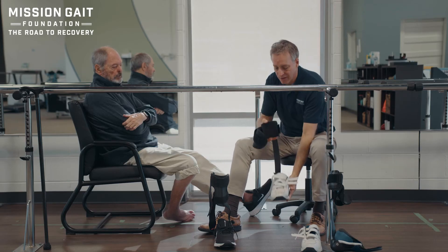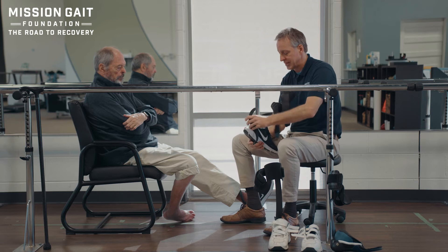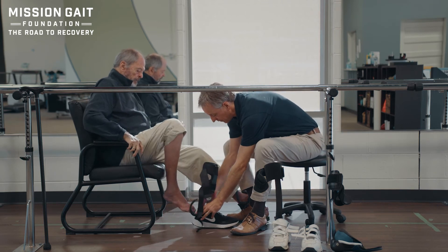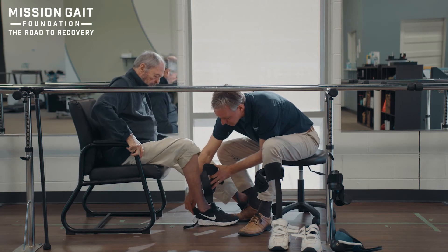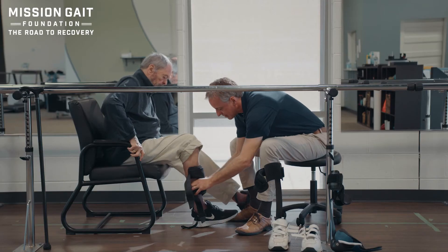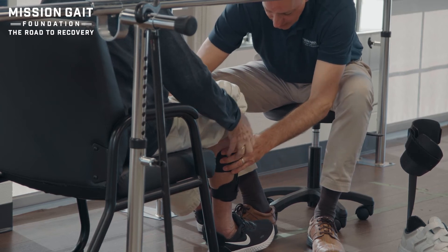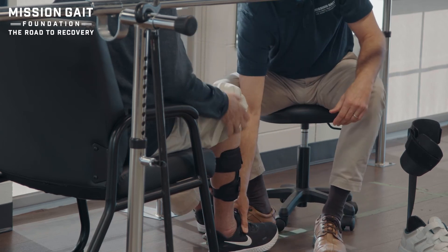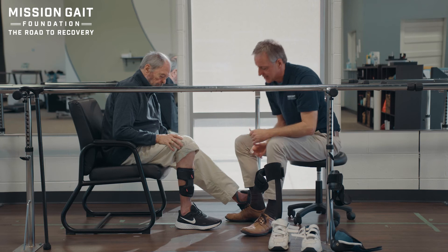Let's show you putting this on. The patient normally steps into the brace with it in place. Go ahead, Ken - just pick that foot up, step right in there and slide forward. Notice that because we can pull the whole back out of the shoe, it creates a much easier way to slide into that brace. From there, we're going to simply move that plate back into position and stabilize the Velcro into place. Once he's there, he can close the shoe up with the zipper around the back - a simple system to get into place.